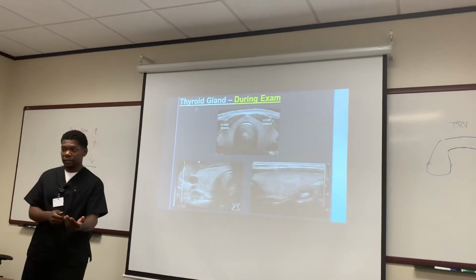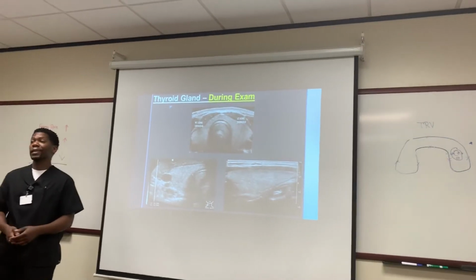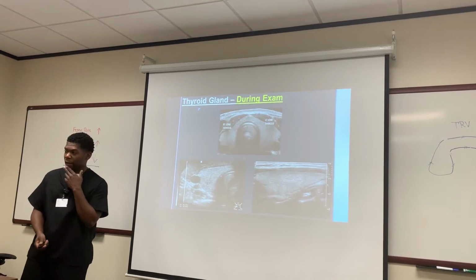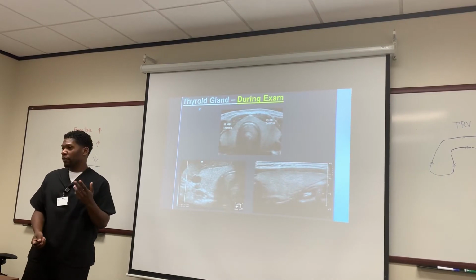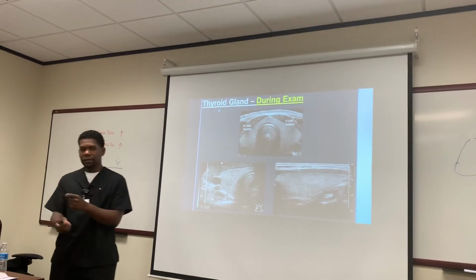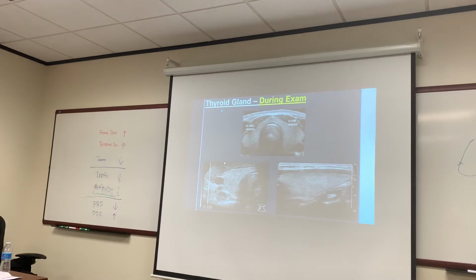But if I'm talking to them, then I'll say how I'm feeling about it. I may say, from looking at this, hypervascular, this person may have Graves' disease. While I'm talking to the doctor, as far as my documentation, no, I'm not going to do that. I'm just going to describe the pathology that I see.